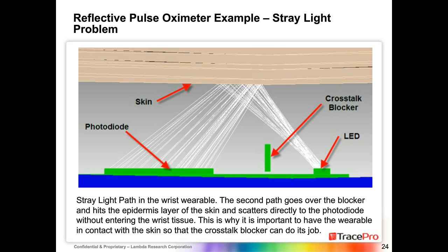Okay, and the last question. Sure. Can you summarize the simulation process to get scatter graphs? I assume 3D input, optical characteristics of detector and emitter, some sort of model for the scattering of light inside the flesh as a function of O2 content. Right, so you're going to specify, using the Henyey-Greenstein function, a phase function that specifies how light scatters through the flesh in terms of O2 content.